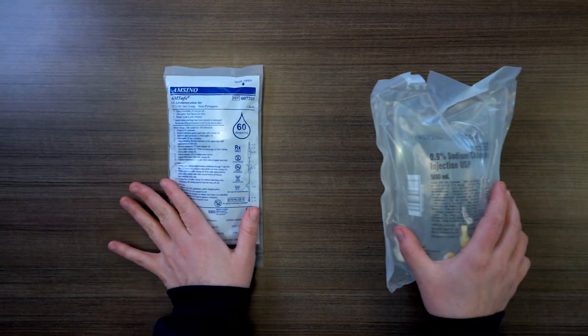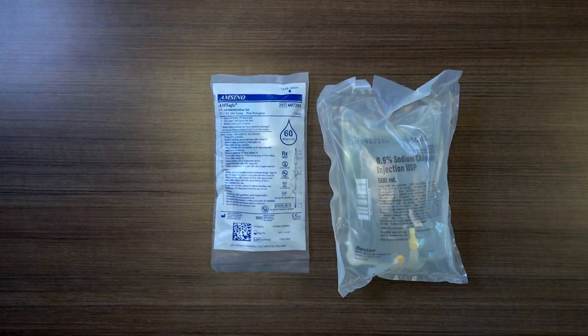The first step is to gather all your materials and then follow all proper PPE precautions. For demonstration purposes today, I won't be wearing gloves.